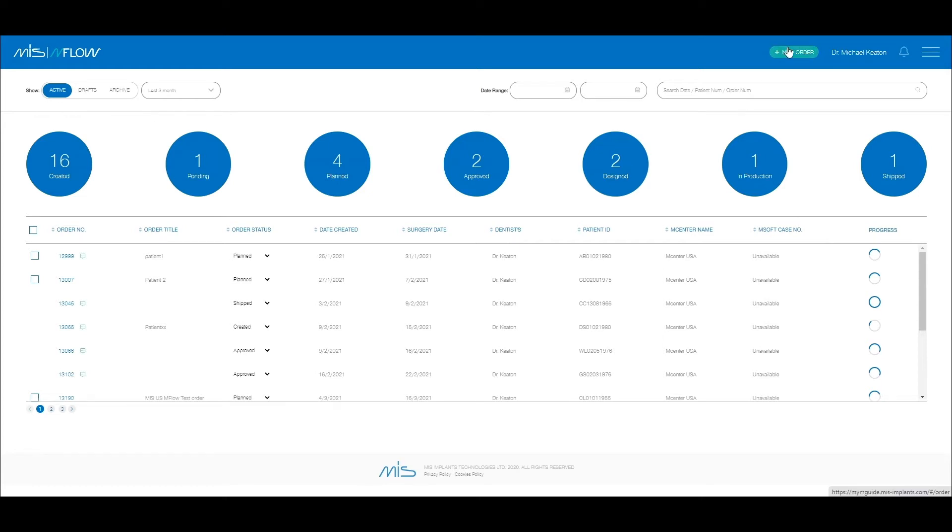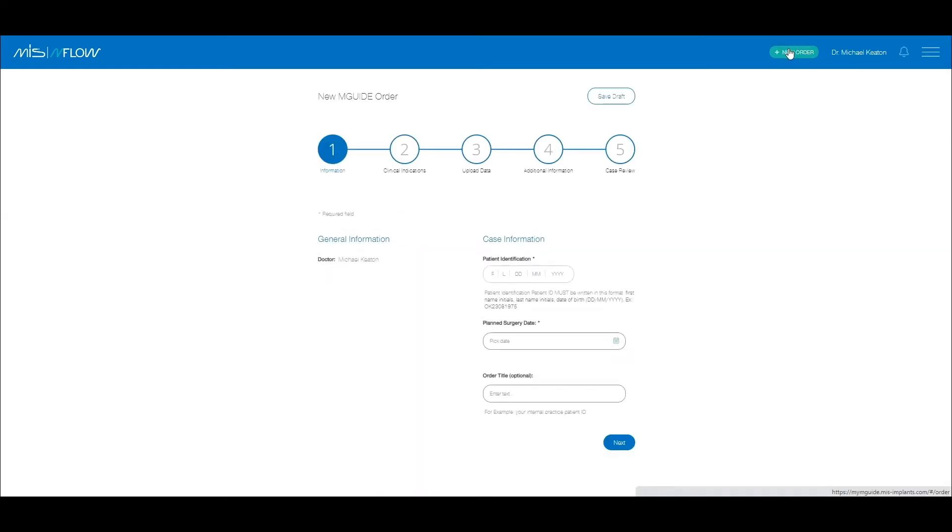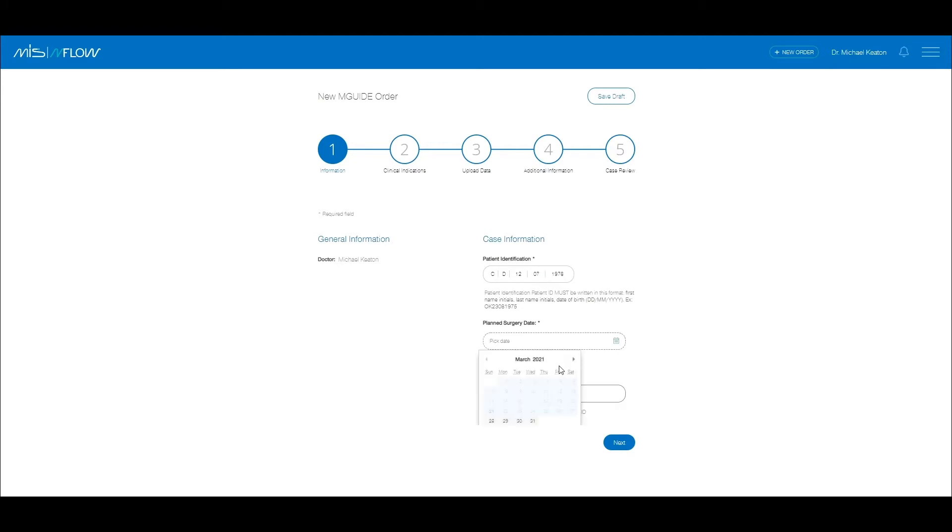To start, click the New Order button next to your name at the top of the page. Fill in the patient identification information in the required format: first initial, second initial, and full date of birth. Then fill in the planned surgery date.